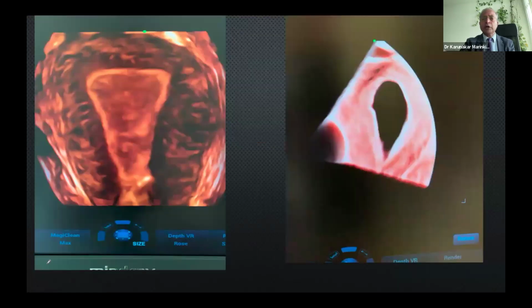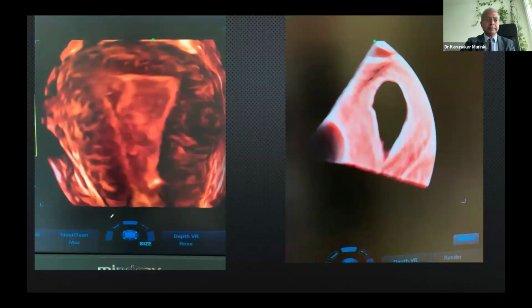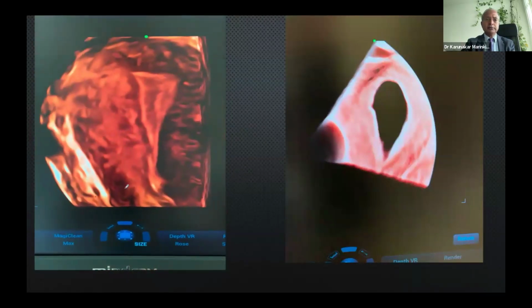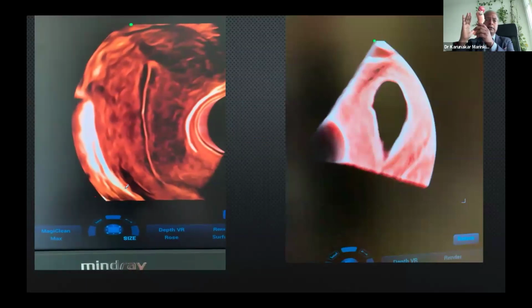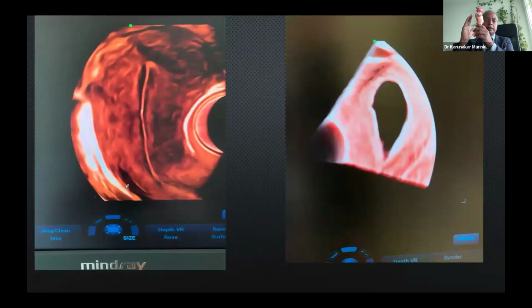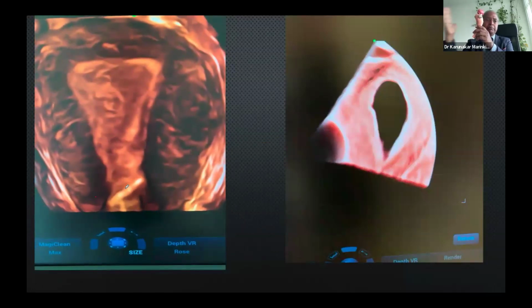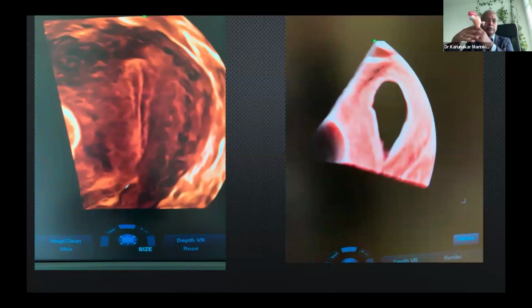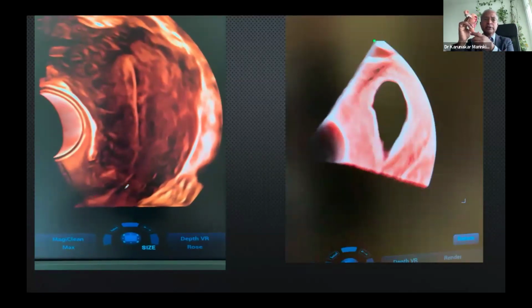Just a couple of examples of how a normal endometrial chamber looks in a 3D ultrasound. This is the anterior posterior view of the uterus, and that is the right sagittal view. The probe is only taking the axial view and sagittal view, but it's computing the AP view. That's all. And you can see the left lateral view. That's your typical endometrial thickness measurement plane.